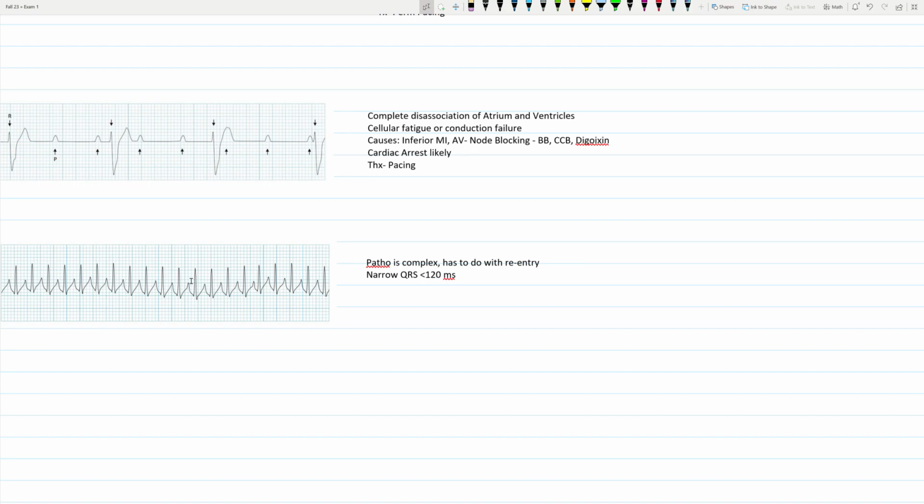Next up on our list would be a synchronized cardioversion. Okay, so synchronized means we're giving it at a synchronized time, matching the heart rate. When you sync with the heart rate, you'll see little pacer marks marking out our QRS complexes here, and we're going to press the shock button on the defibrillator with it synced up, and it's going to deliver a charge to the heart at a very precise time to put that patient back into rhythm.